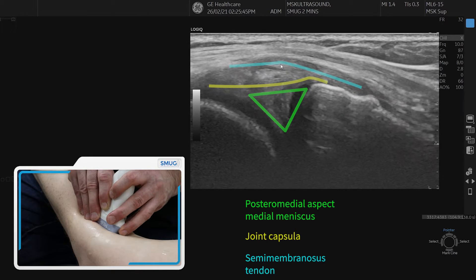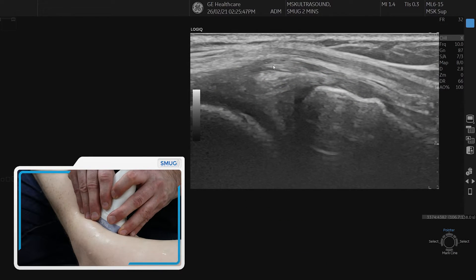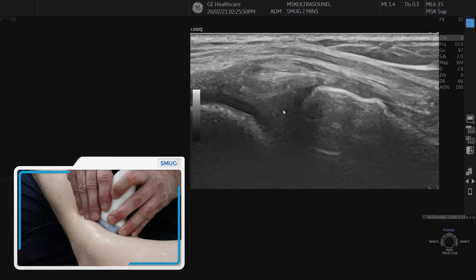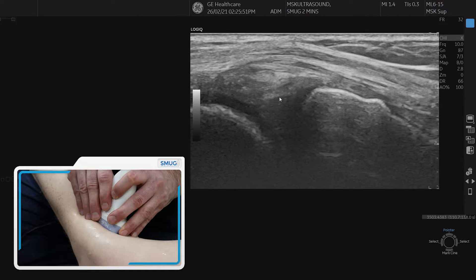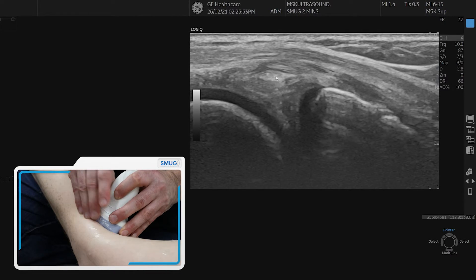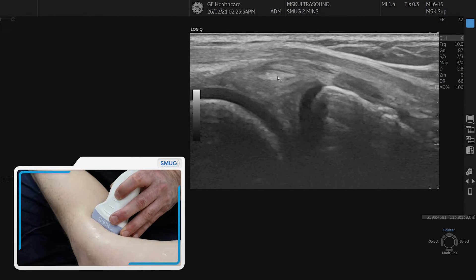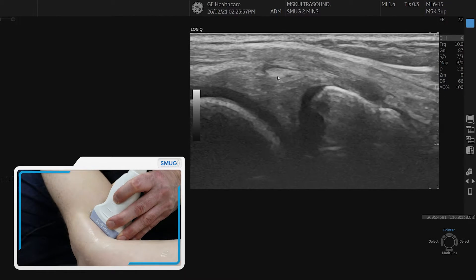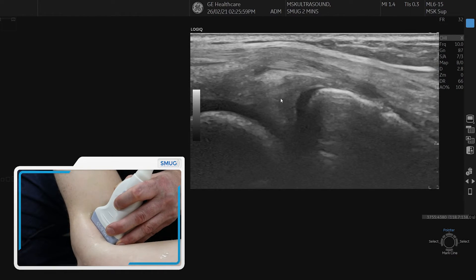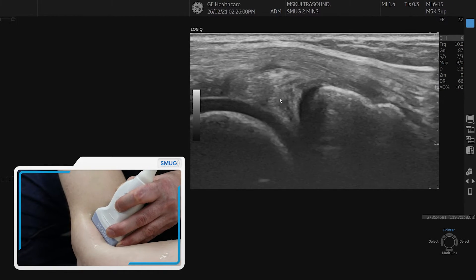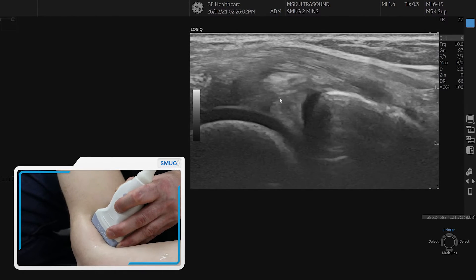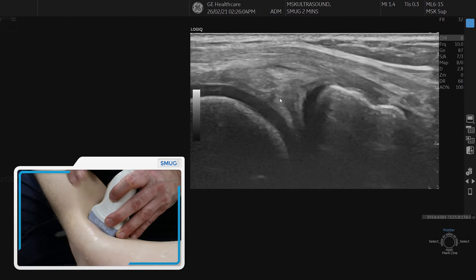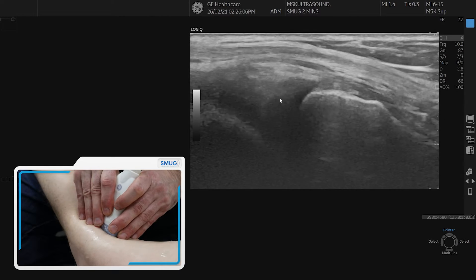If you angle it a little bit, you can literally see the peripheral margin where it stops — there's a white line and the capsule just on top. In this position you can do an assessment by bending the knee slowly and see how the capsular and meniscus unit move together. That is the assessment of the posteromedial meniscus and its various layers.